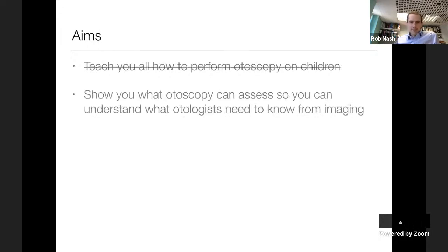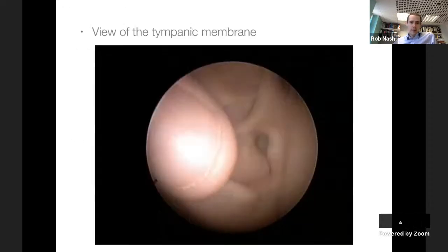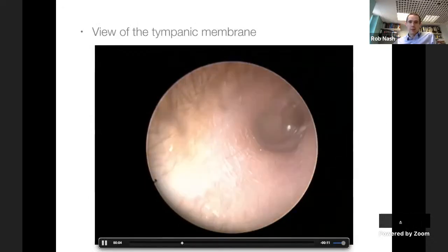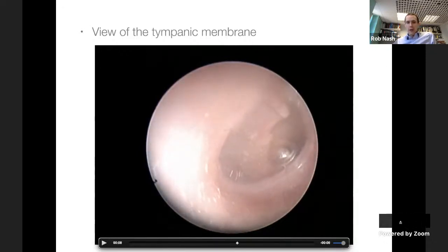Obviously I'm not here to teach you about performing otoscopy - I'm here to show you what otoscopy can reveal in an ear, so you can understand what it can't show, and that's what we request imaging to find out. This is a standard view of a tympanic membrane with an otoendoscope. Looking inside the ear canal, you get a lovely view of the ear canal on the way in and a clear view of the whole eardrum.